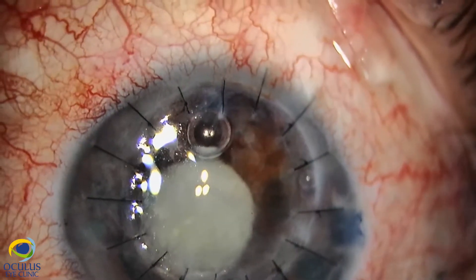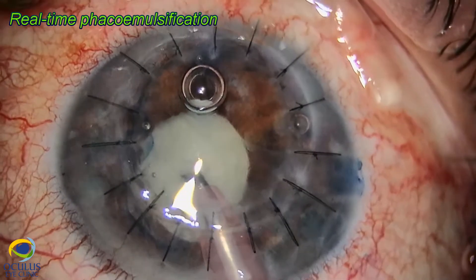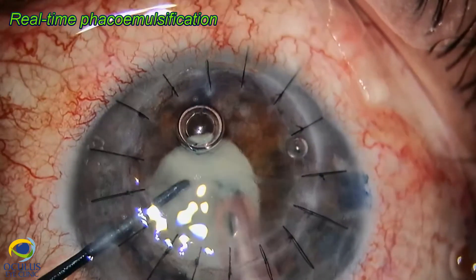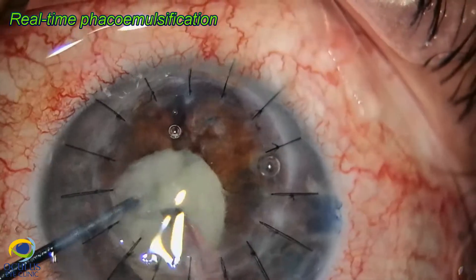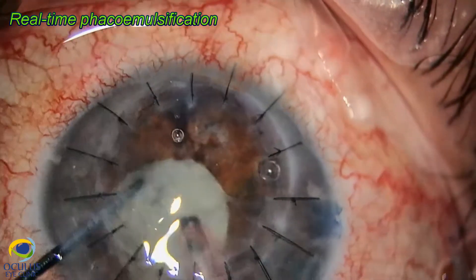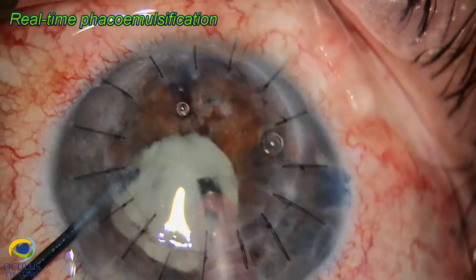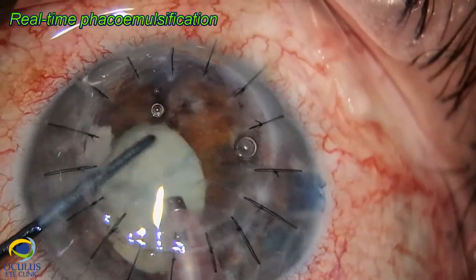Hydrodissection and rotation were not difficult, and now we started phacoemulsification using the Centurion machine with a balanced tip. I entered with the tip into the center of the nucleus quite deep and with the Nagahara chopper up to the periphery of the bag equator, cutting in a three-dimensional movement to divide the nucleus into several pieces. Using only torsional energy — no more than 50% maximum — is especially important in cases with a corneal transplant or low endothelial cell count, where you aim for the lowest energy efficient for the given nucleus.